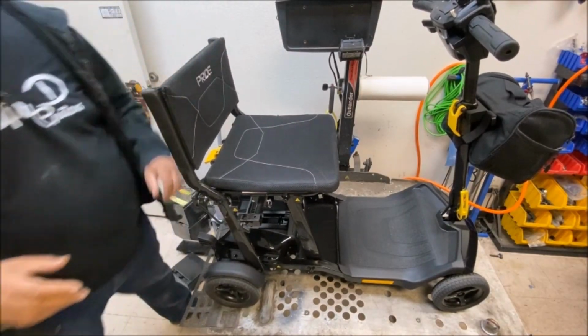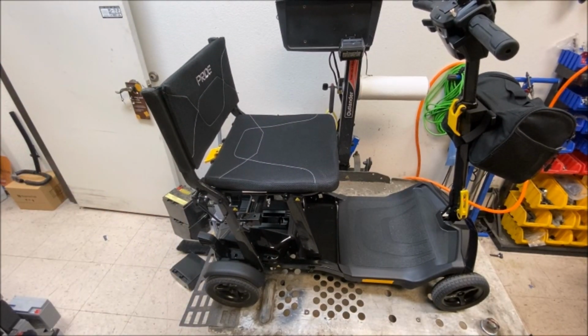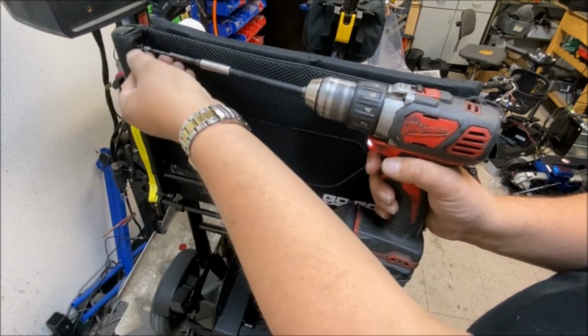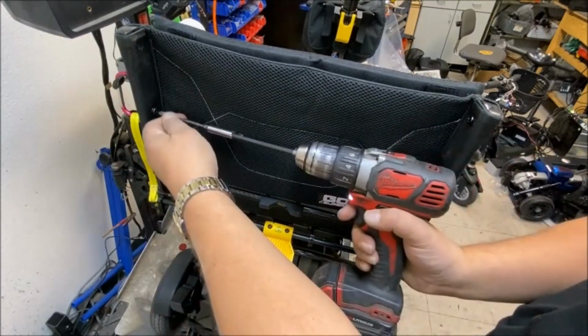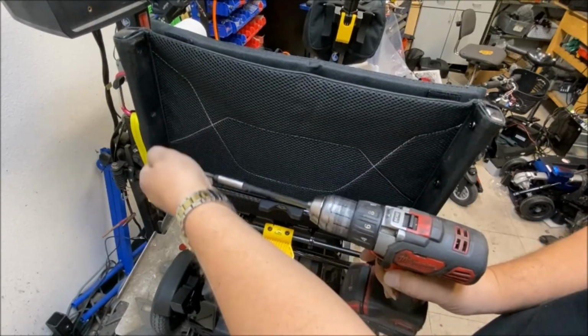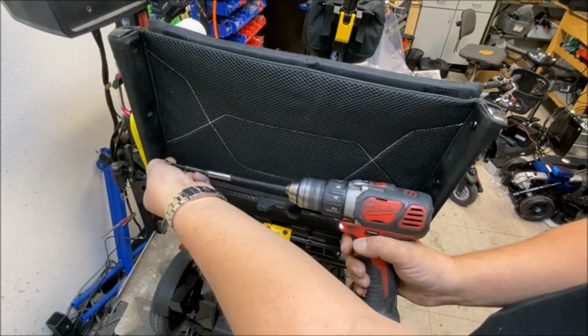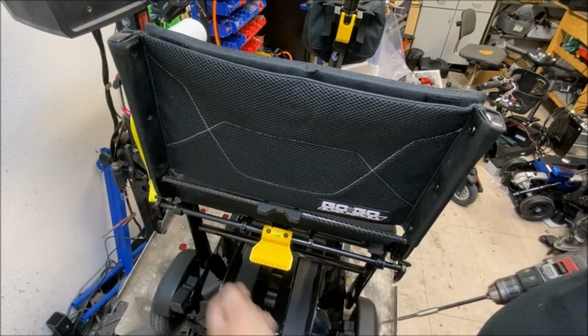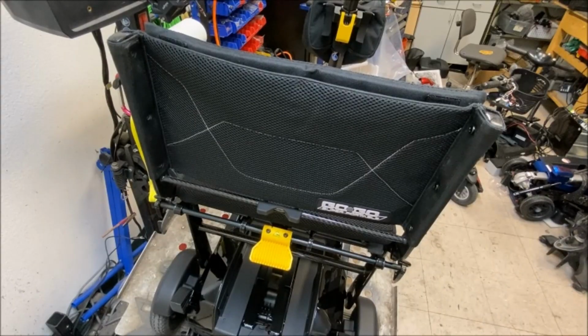But this was a different question. So to answer the customer's question, can you make it go faster? No, you can't make them go faster. Well, you can, but you'd have to change the controller out. But no, the question I got asked by this customer was, can I make it go slower, even at the set slowest speed? The customer's wife had dementia, and even though it was slow, she couldn't go slow enough. So could you slow it down?